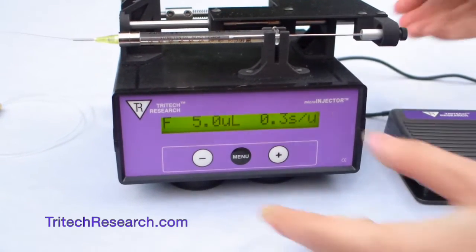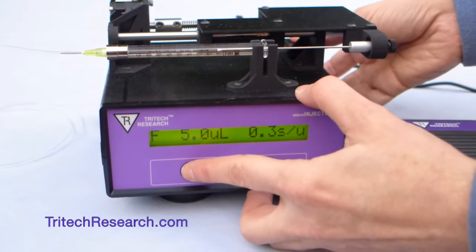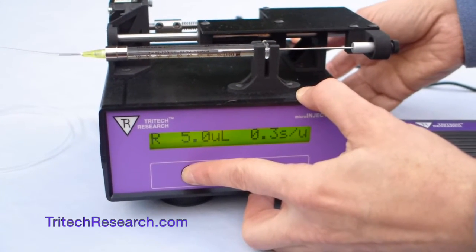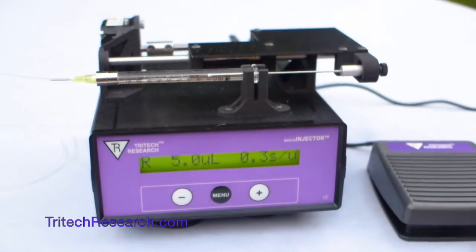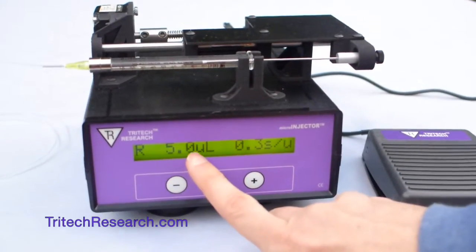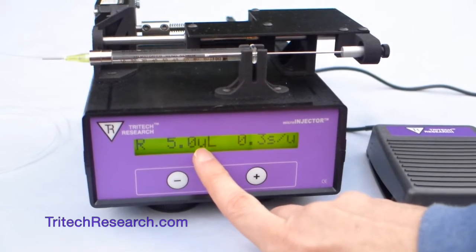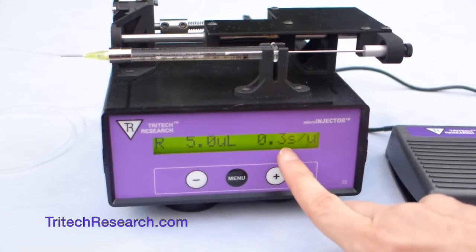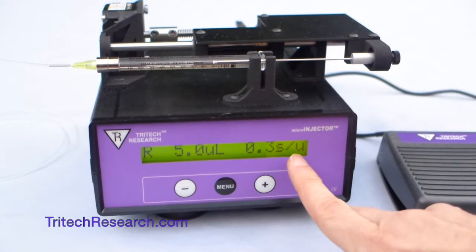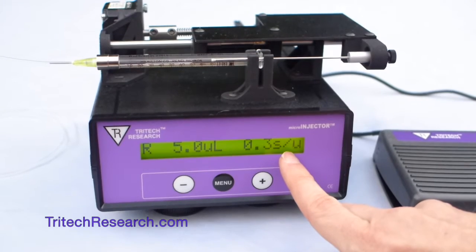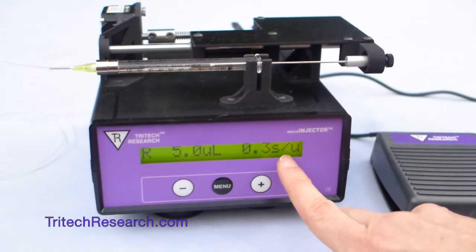That can be controlled by pushing the minus button in this mode, so it can go reverse or forward, depending on which you do there. And then the other two things, this shows 5 microliters, that's the amount that it's set to inject, and a speed of 0.3 seconds per microliter, so that means it's going to inject the 5 microliters in under 2 seconds.